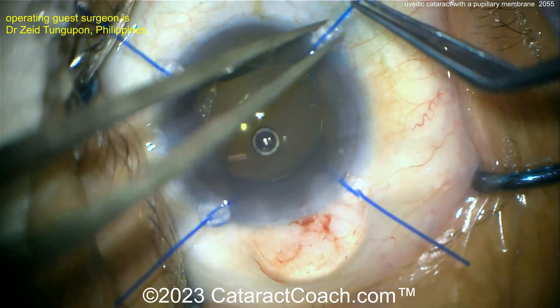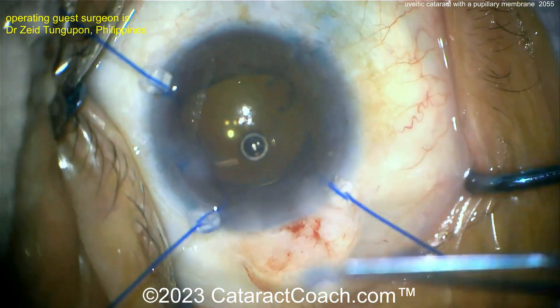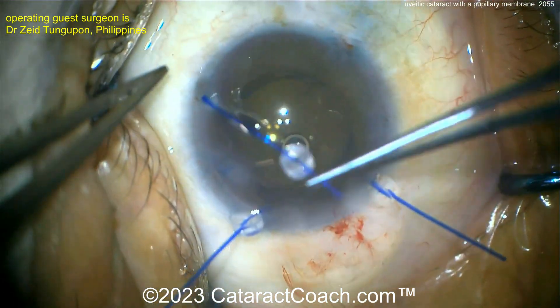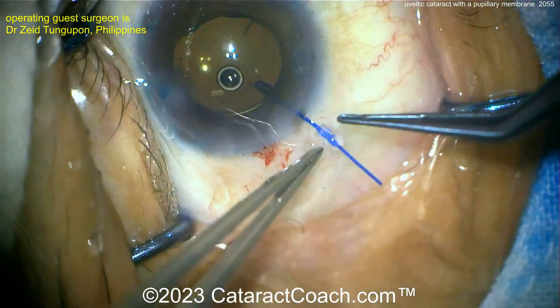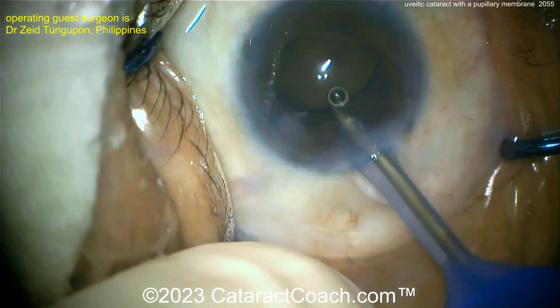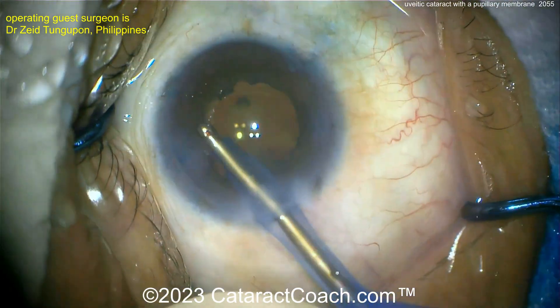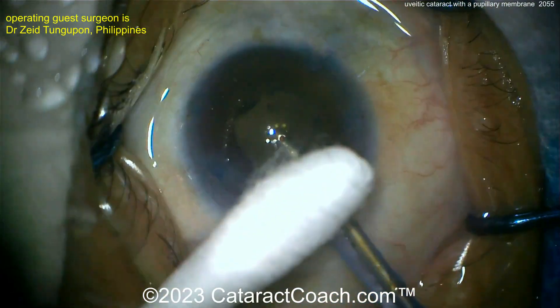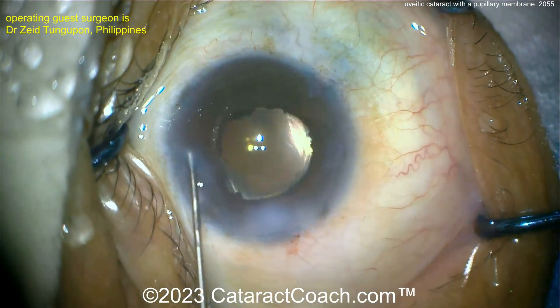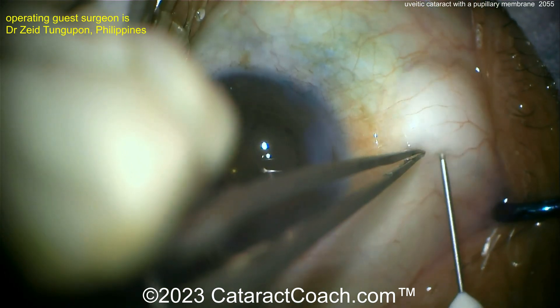Give patients extra triamcinolone. Taking out the iris hooks — I like removing them prior to taking out the viscoelastic. Watch the patient carefully in the post-op period: higher incidence of CME (cystoid macular edema) in these eyes because of prior uveitis, and they may have a prolonged inflammatory response after surgery, which we can manage. Beautiful surgery — thank you for submitting this. Keep these pearls in mind when you have a similar case. And there's the steroid injection.